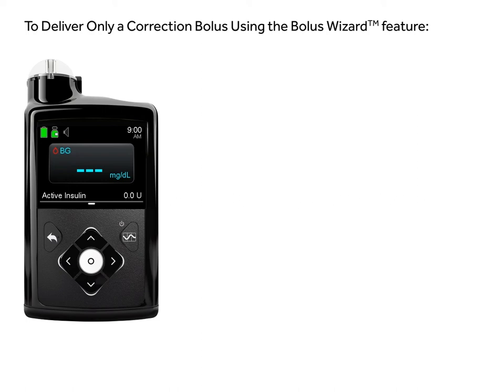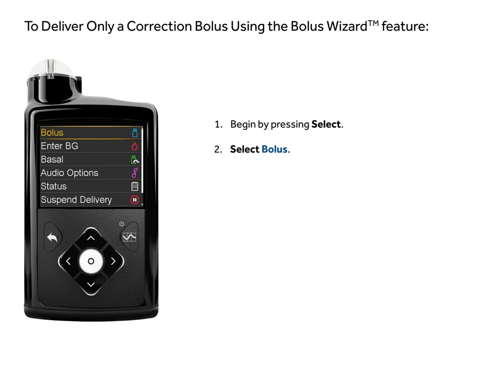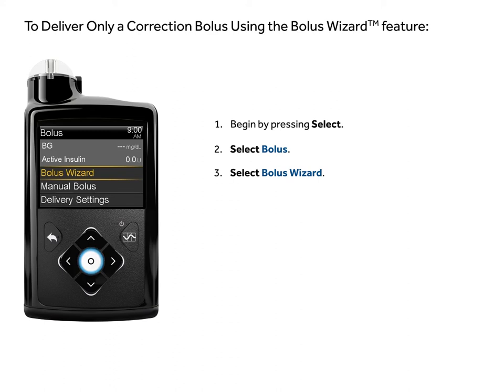Begin by pressing select. Select bolus. Select bolus wizard.